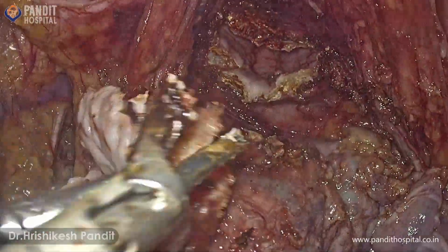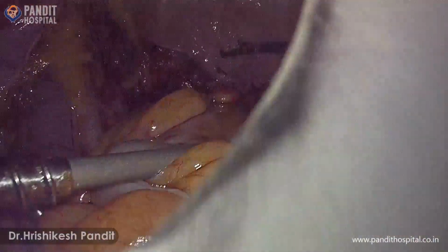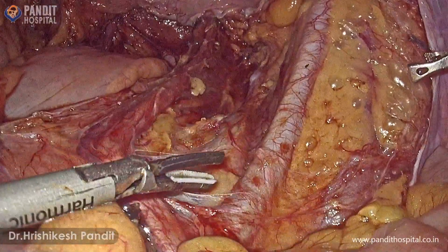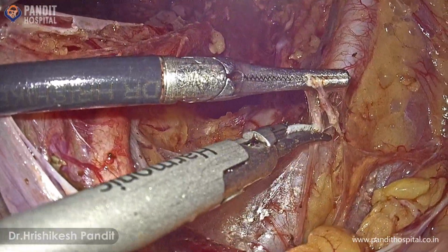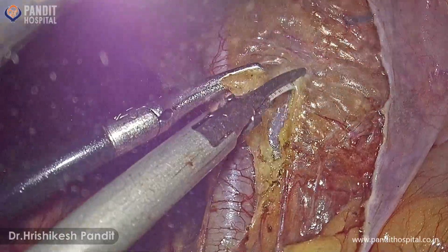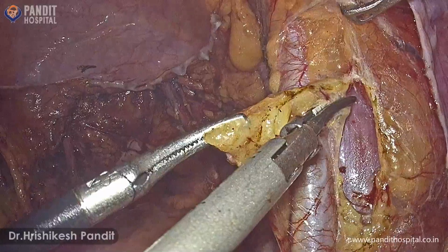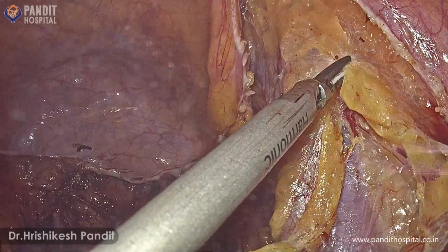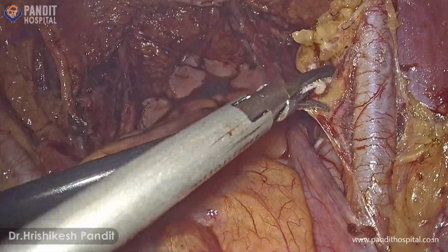Now we move on to the second part of the surgery, that is bilateral pelvic lymph node dissection. The lateral limit of dissection is the genitofemoral nerve, which is lying on the psoas muscle lateral to the external iliac artery. Short bursts of cutting currents are given. Care is taken to prevent any injury to the great vessels lying on the lateral pelvic wall.